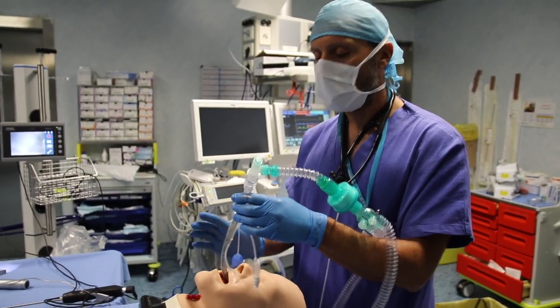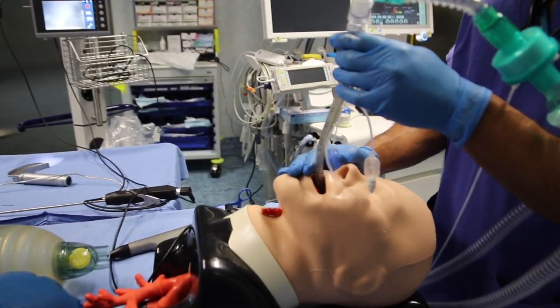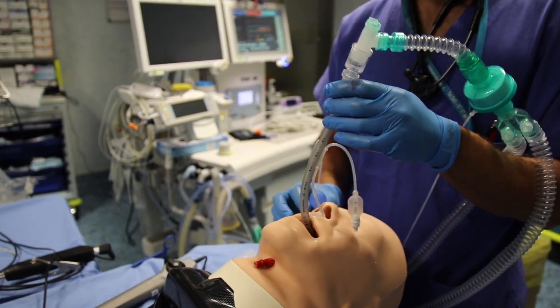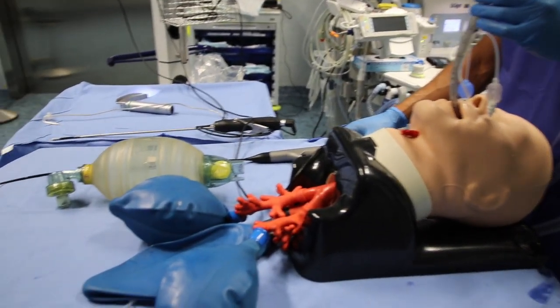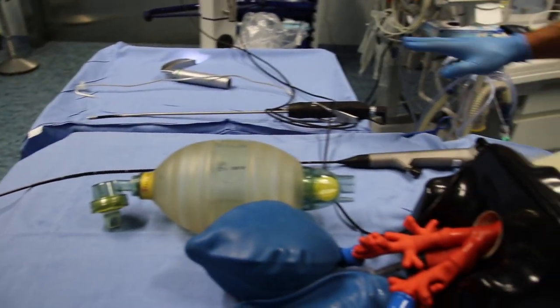We are starting with ventilating the patient with a spritz tube in a supraglottic configuration. Now we are going to intubate the patient. In the previous videos, we described the procedure using a video laryngoscope and a rigid fibroscope. And now we are going to see how the spritz tube performs paired with a flexible fibroscope.